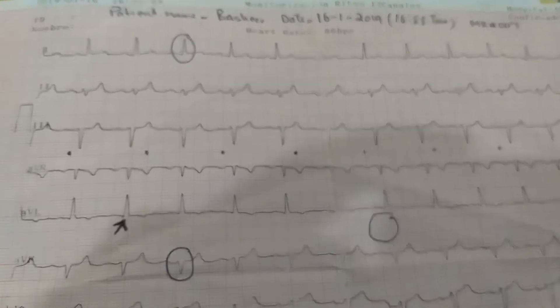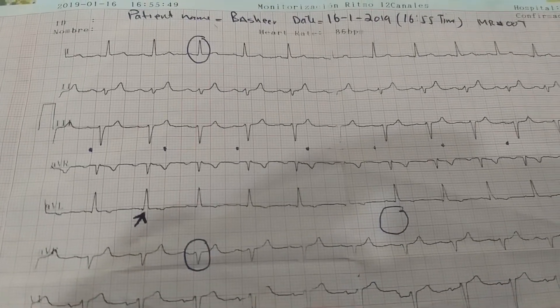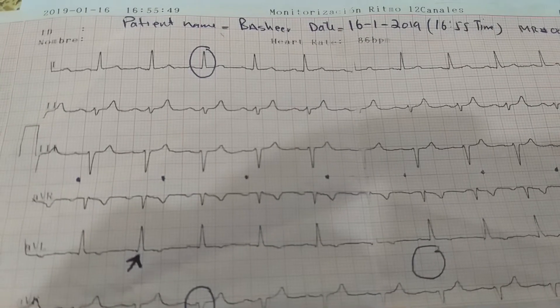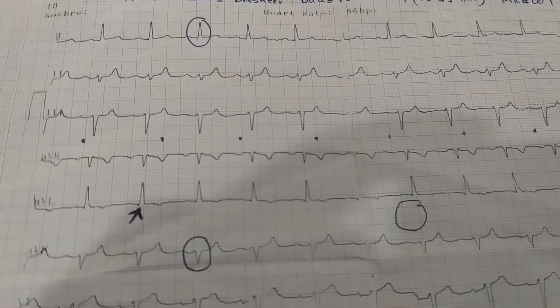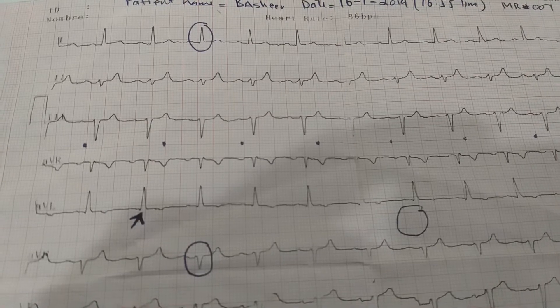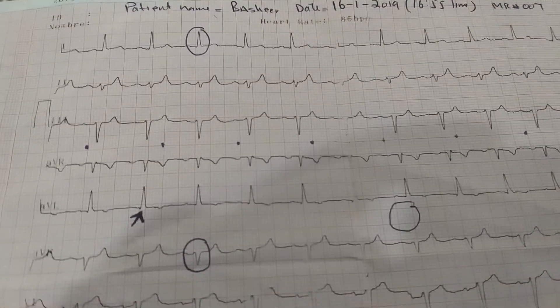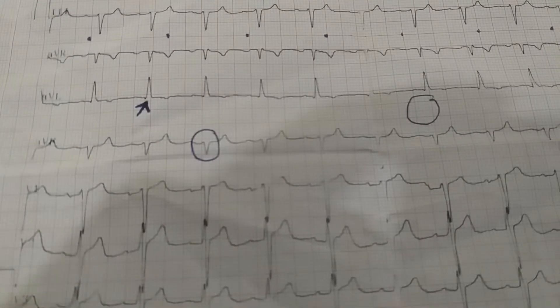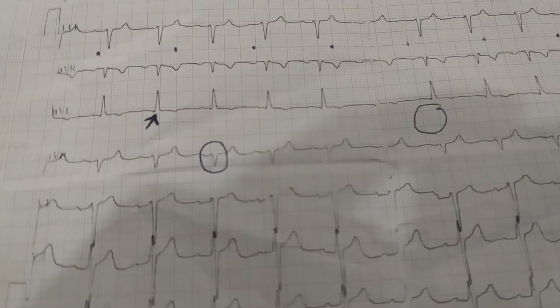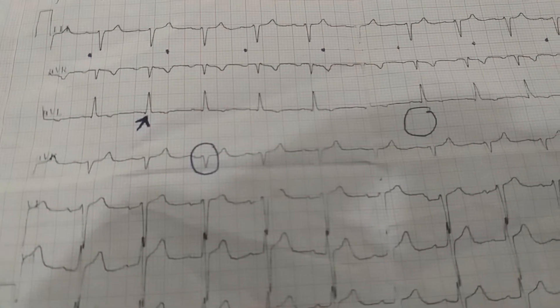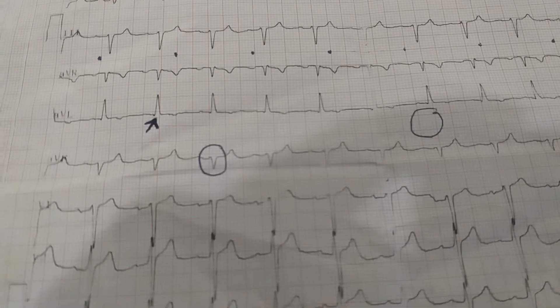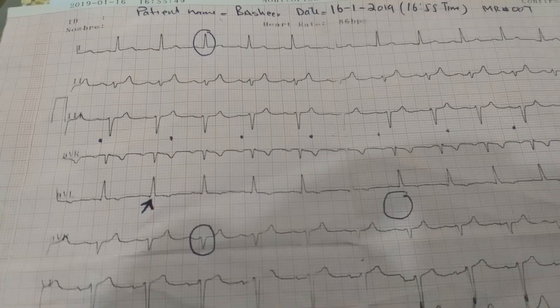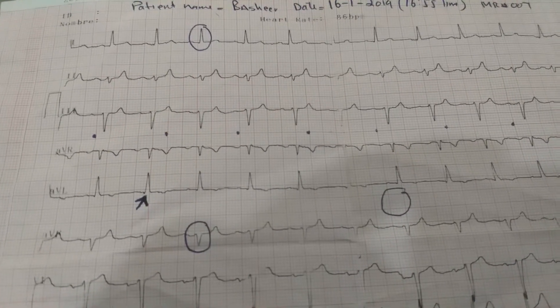Taking the example of this patient, there is no right axis deviation because lead I is positive and lead aVF is negative. And looking at lead V1, it has a very small R wave and a deep S wave. Since our definition requires a tall R wave in lead V1 and right axis deviation, this ECG has not got right ventricular hypertrophy.